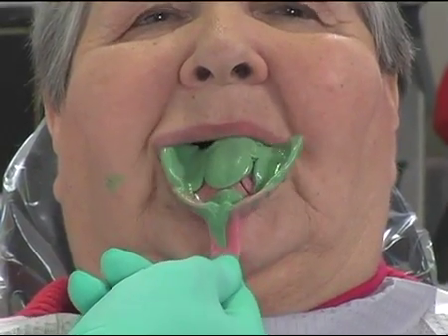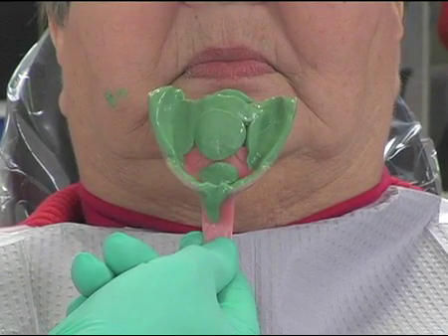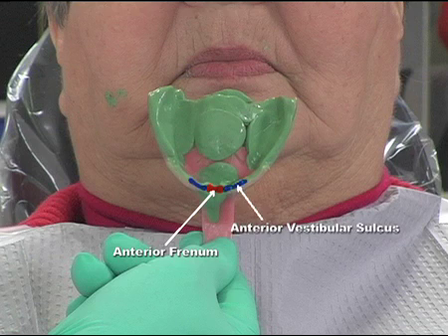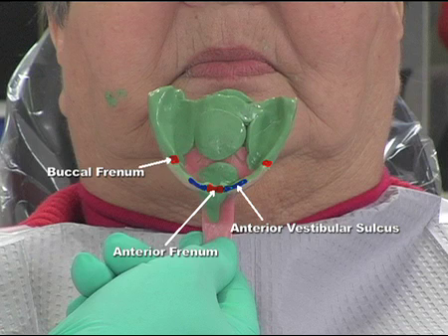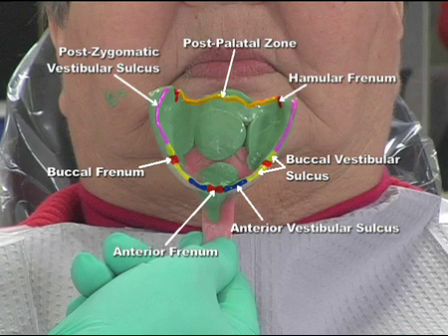Remove the impression and evaluate the detail. Note the anterior frenum, anterior vestibular sulcus, buccal frenum, buccal vestibular sulcus, post-zygomatic vestibular sulcus, hamular frenum, and the post-palatal zone.